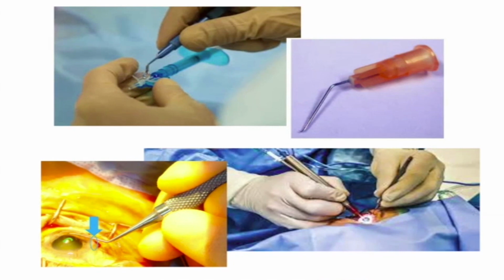And very important, even though you may not achieve 100%, is to always know the principle of the instrumentations. I always emphasize this is the most important thing for microsurgery. So always know the principle of pivoting your instrument, how to handle your instrument and also manipulate the instrument when you are inside a very close and small space.